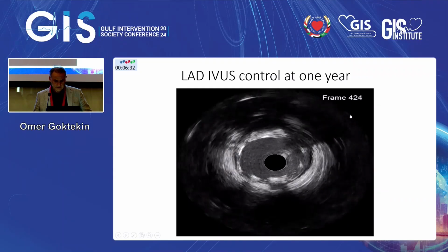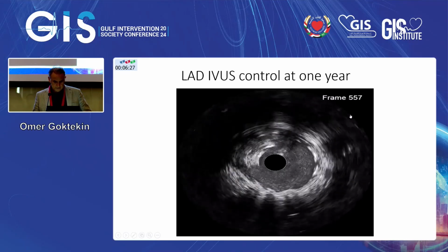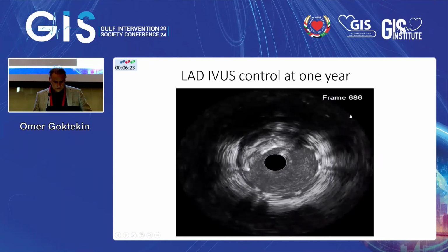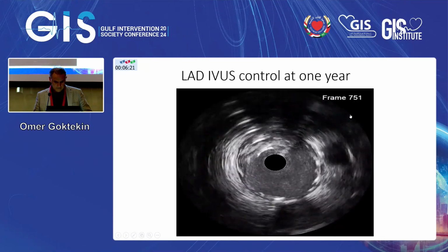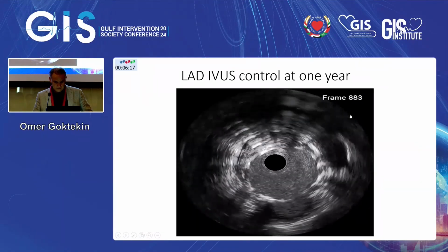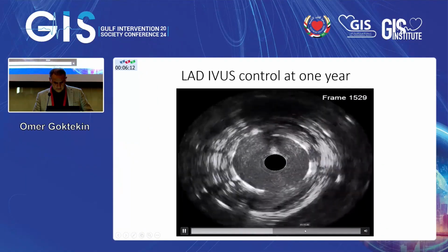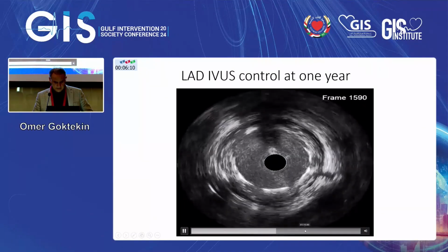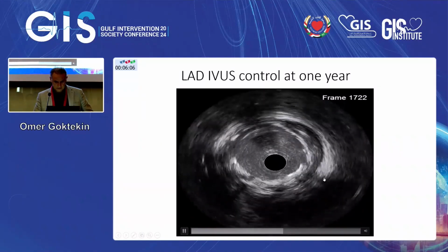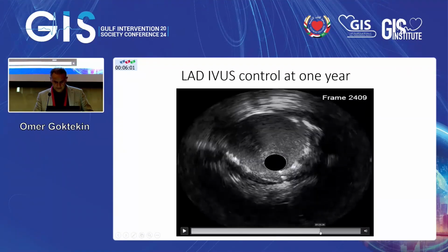I think we have an excellent result here. Even though we did 4.5, it still looks to me like maybe we could do 5.0. It's a very big artery.